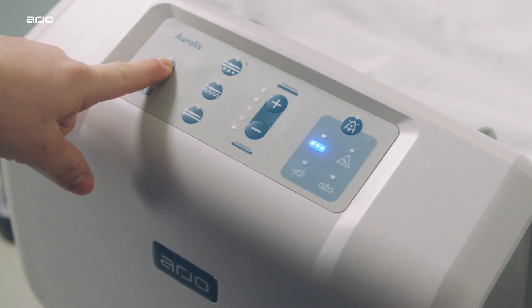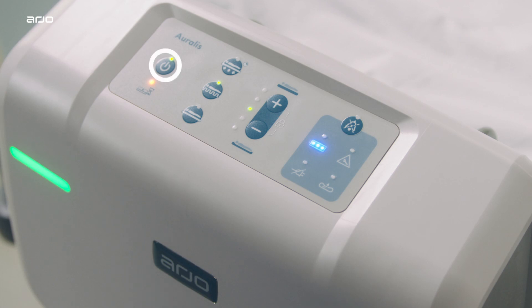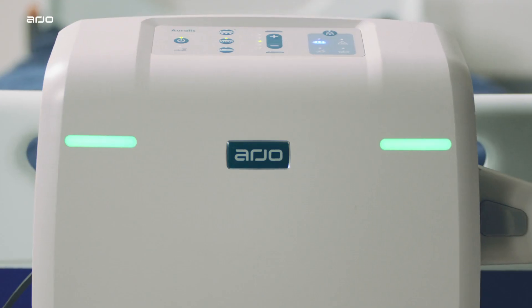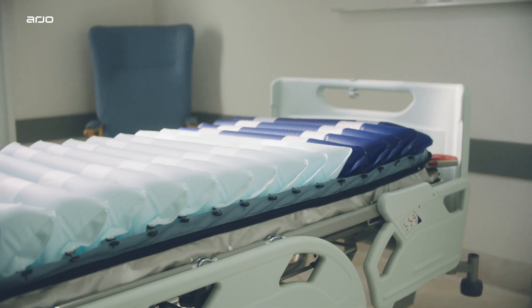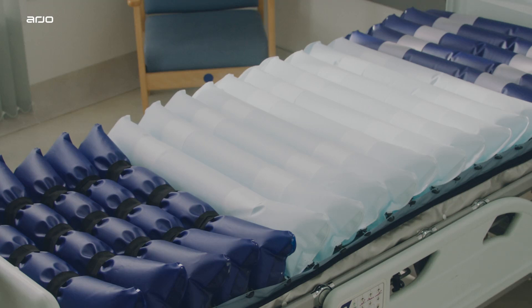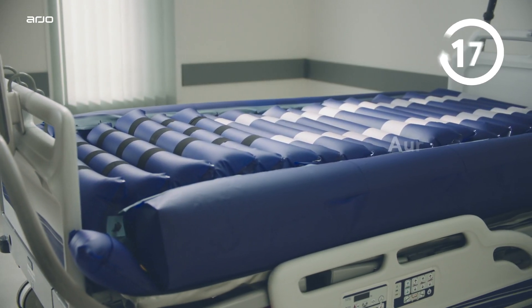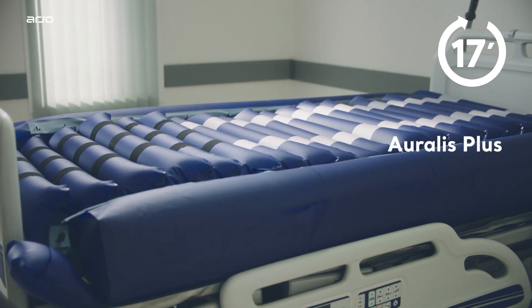Press the Run Standby button on the control panel for two seconds. The following indicators are then shown: Run Standby, weight indicator, alternating mode button, comfort control indicator, battery charge indicator, and green indicators on the front of the pump. The Oralis mattress is fully inflated when the weight indicator is off after approximately 15 minutes, whilst the Oralis Plus mattress takes approximately 17 minutes to reach full inflation.